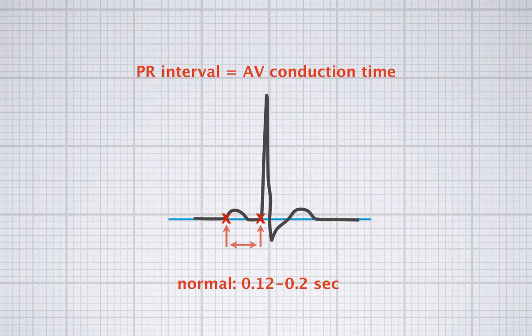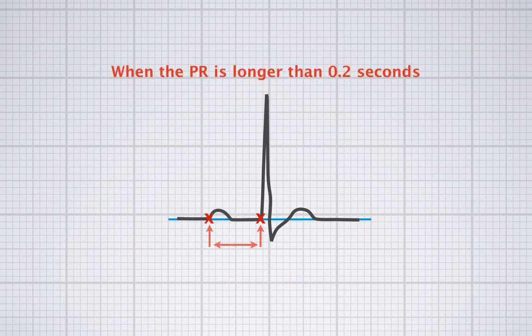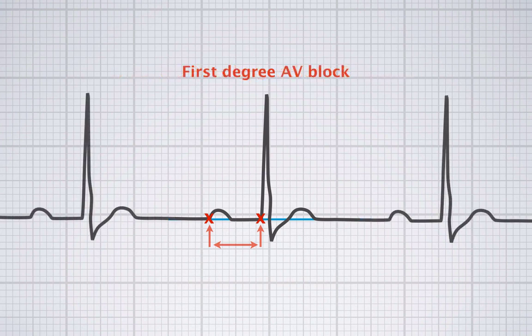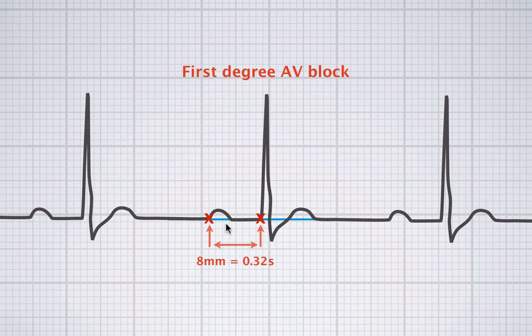Let's look at some situations when the PR interval is considered abnormal. First, let's look at a situation when the PR interval is longer than 0.2 seconds. As you can see, the PR interval is almost 8 millimeters long. We know that 1 millimeter stands for 0.04 seconds, and 0.04 times 8 is 0.32 seconds — that's way over 0.2 seconds. In this special case, there is a constant prolongation of the PR interval, and this is an example of a first-degree AV block. You're going to learn much more about this entity in later chapters.